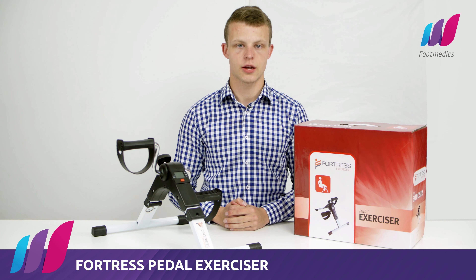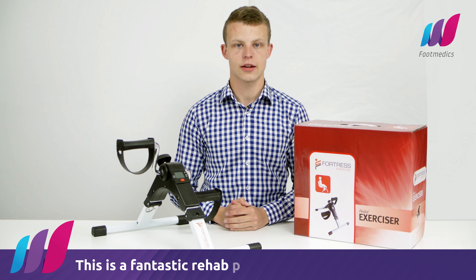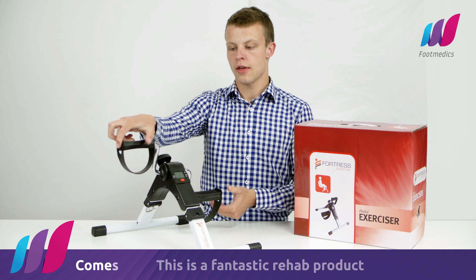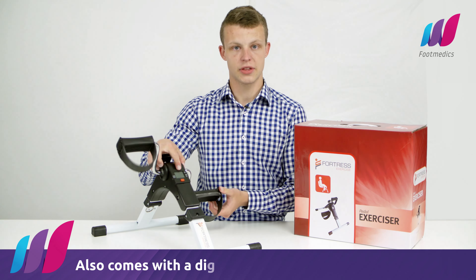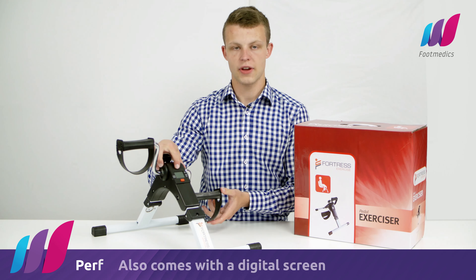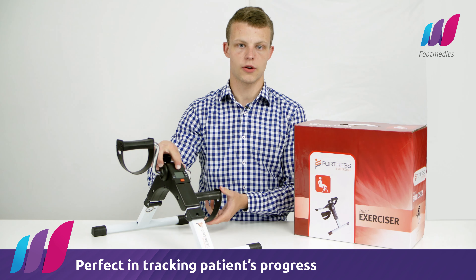Hello, my name is Paul and I'm introducing the Fortress Pedal Exerciser. These are a fantastic rehab product. They come with non-slipping foot pedals. They also come with a digital screen, perfect for you to track your patient's progress.